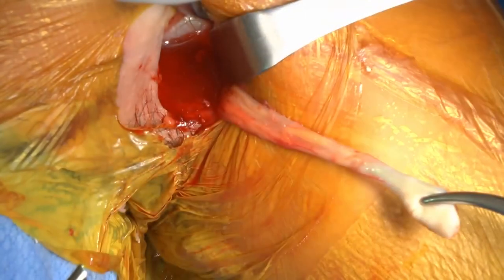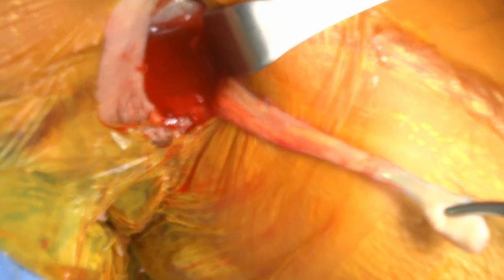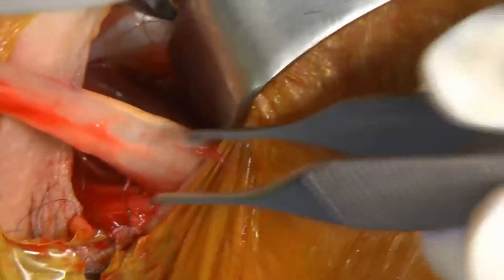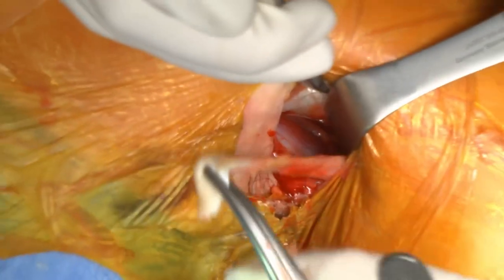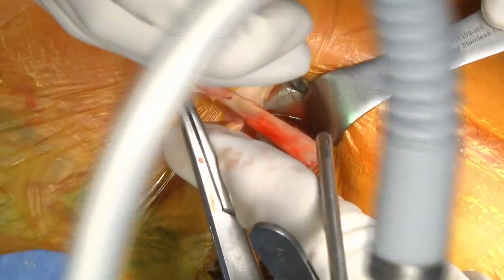And then our goals in terms of our landmarks when we want to do our actual reconstruction is we want to get the muscular portion of the biceps, which is right here, underneath our pec. You can see Deb is holding back on that. So this is where it needs to go to get that firmly into place. So again, what I need to do is get that muscle to that level all the way up to there so that that will go into place.